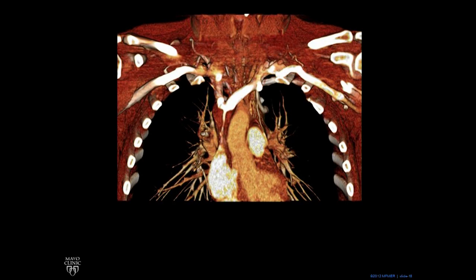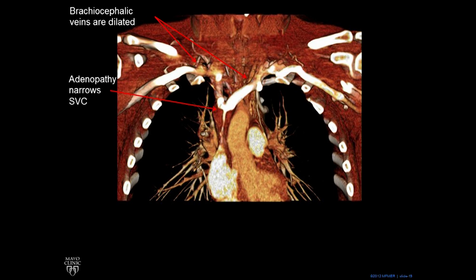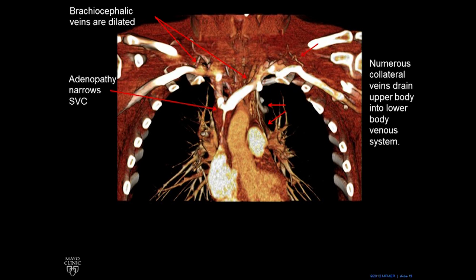We peel away to the CT scan, and you can see there's adenopathy — a mass encasing the superior vena cava. The brachiocephalic veins, which drain into the vena cava, are dilated. And there are numerous collateral veins draining the upper body into the lower body venous system. All these veins are abnormal — they're trying to bypass the SVC to drain the upper body into the lower body.